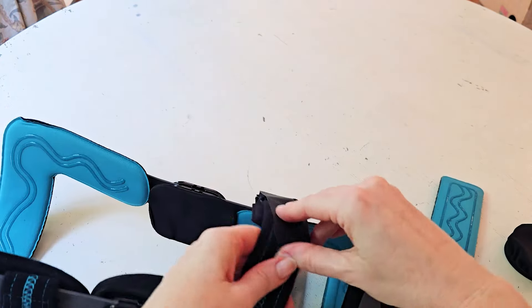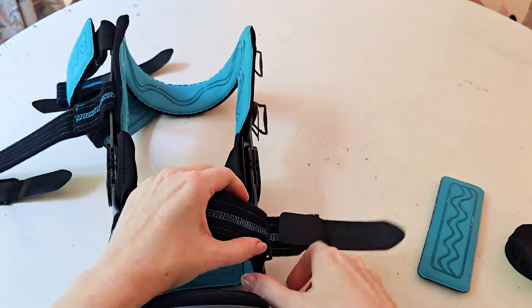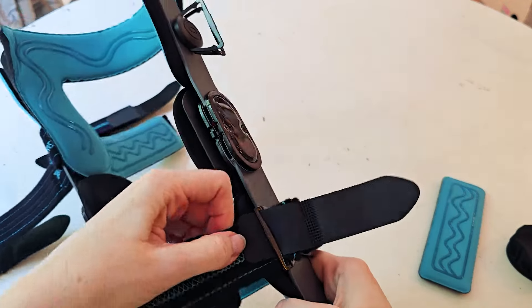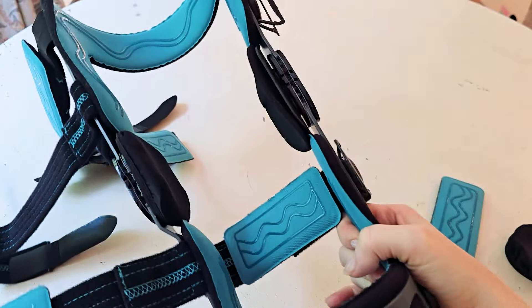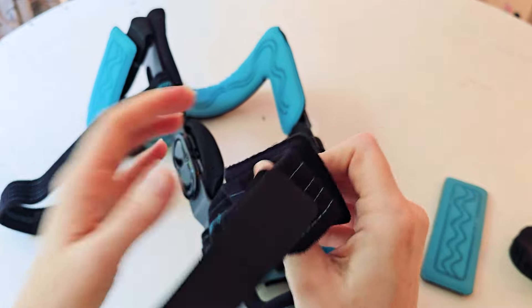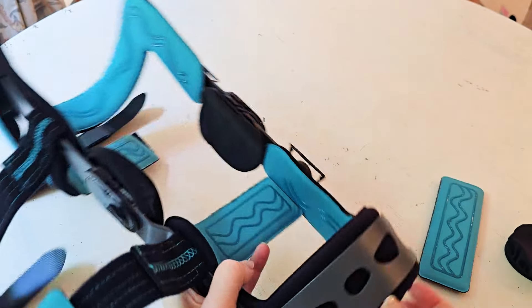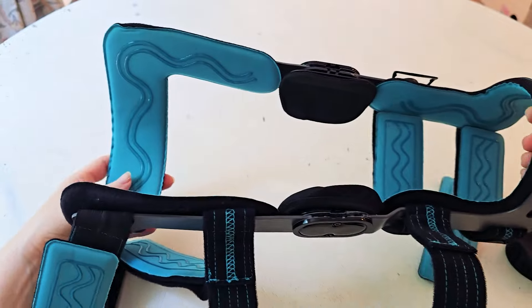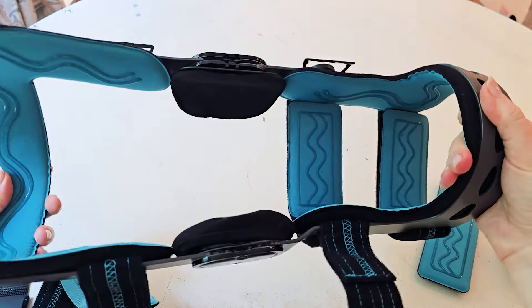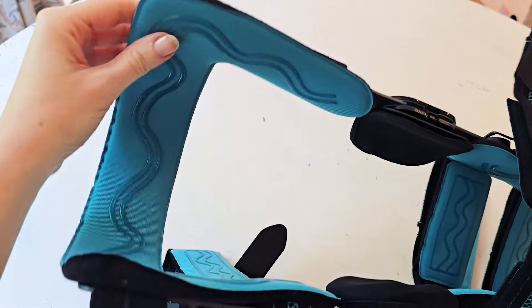Each one of these pieces on the inside — like that blue piece — are a good size and can all be removed, moved around, and adjusted. That allows you to really make it fit and form-fit around your leg, calf, and thigh to make sure everything is properly fitted and comfortable.